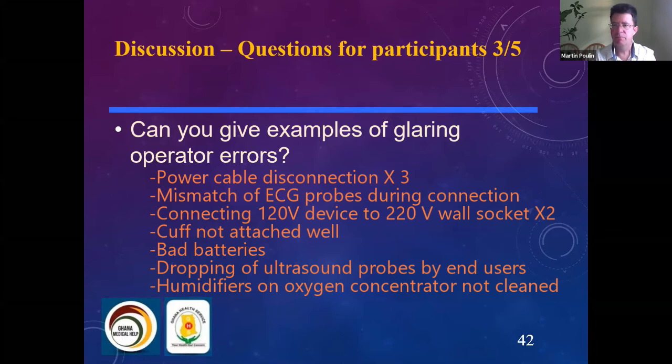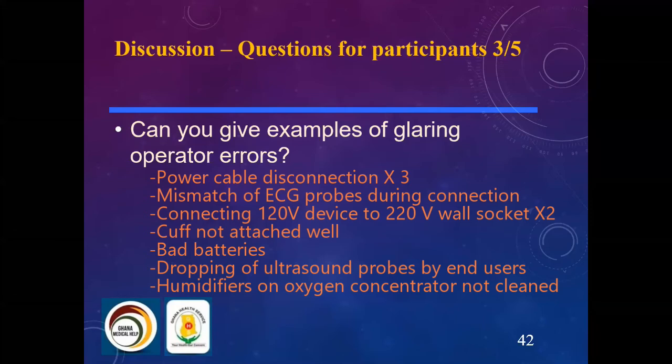Another example here. Question 3, yeah. Cleaning of humidifiers on oxygen concentrators. They're supposed to be regularly cleaned, but nurses always forget to clean. The residue blocks the pathway. They call me telling me the concentrator is not working, but it's actually just blocked. It needs to be cleaned.